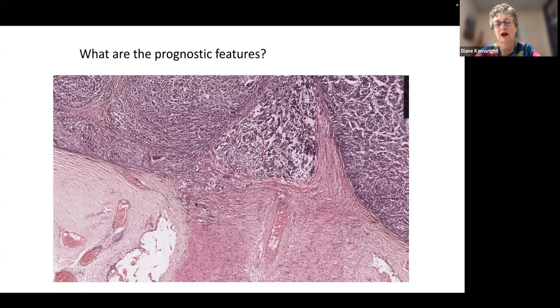So this is a close-up of the optic nerve, the lamina cribrosa here, and this is the tumor. We're getting the impression it might be a spindle cell tumor because we've got slightly streaming areas here. But most importantly, this is the lamina cribrosa, and this is the post-laminar optic nerve, and we can see that we have intralaminar invasion.